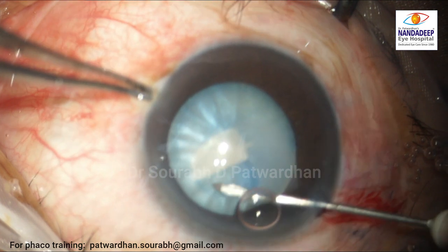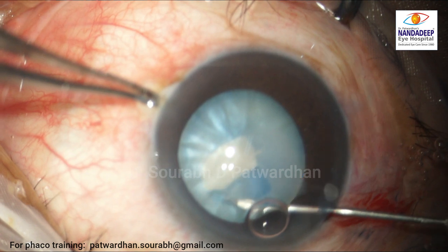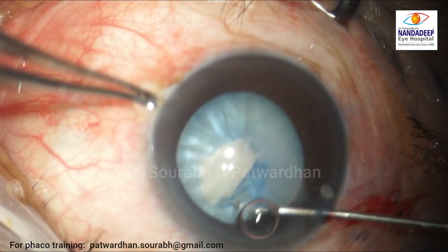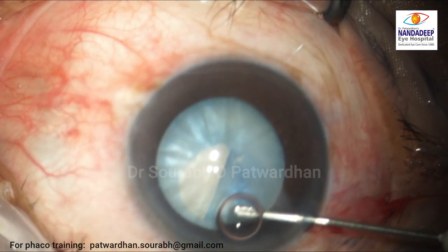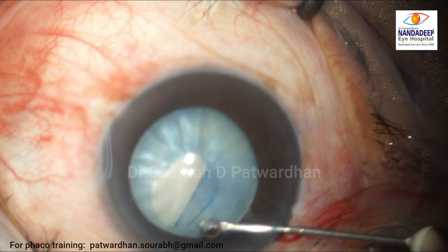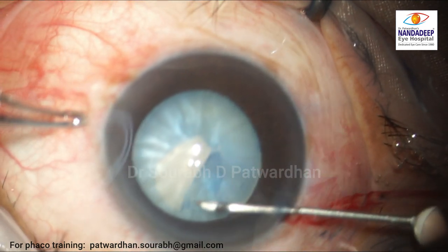The surgeon starts off and has already left the central 5–5.5 millimeter circle, so now the surgeon is treading into dangerous territory. The zonules are quite nearby, and luckily so far the CCC has not extended. The surgeon now aspirates the air bubble which was obstructing the view, which is good.